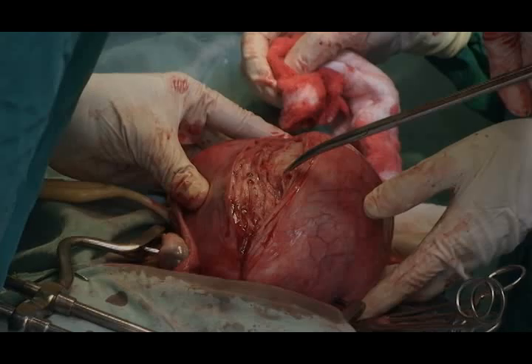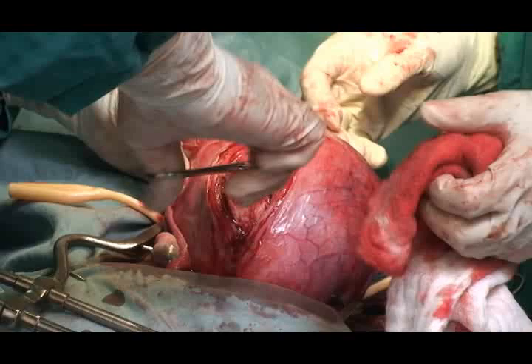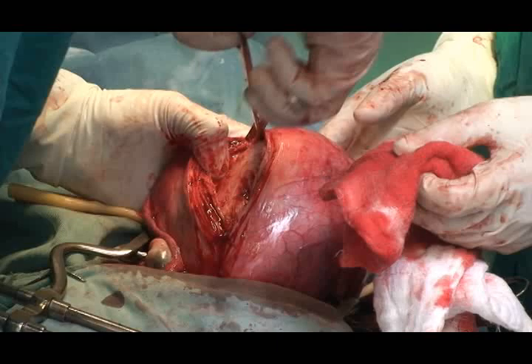Sometimes it may be difficult to remove all the myomas through a single incision, and additional incisions may be necessary. However, one should avoid making multiple incisions as much as possible, since this increases the risk of adhesion, pain, and hemorrhage.